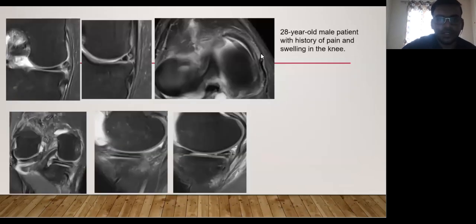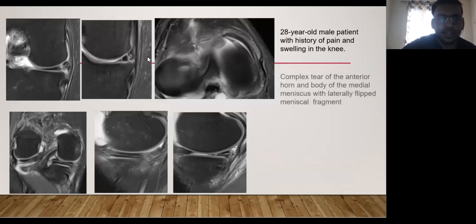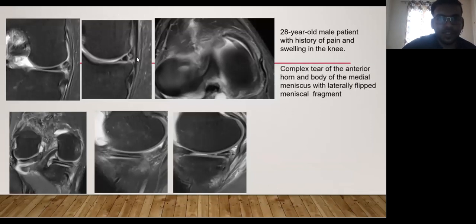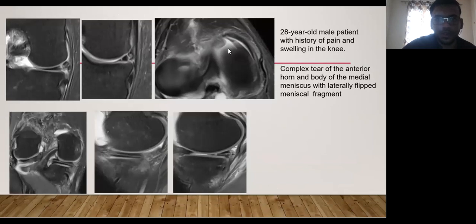Next is a case of a 28-year-old male patient who presented with a history of pain and swelling in the knee. In these images, we can appreciate a complex tear involving the medial meniscus, particularly the anterior horn and body portion, with a slightly laterally flipped meniscal fragment. This is considered an important complication associated with meniscal injuries.